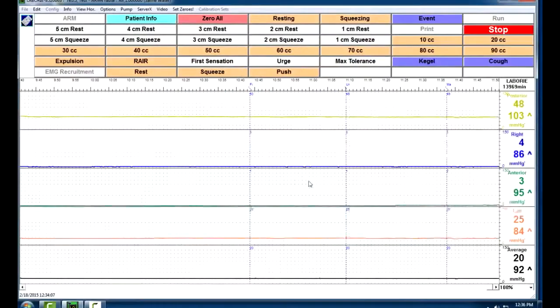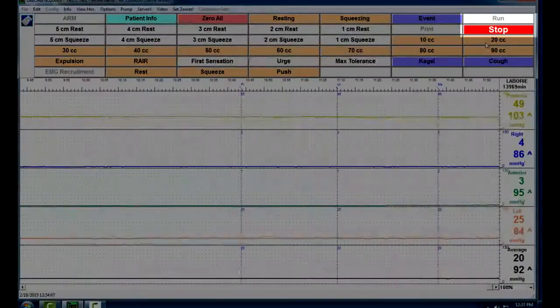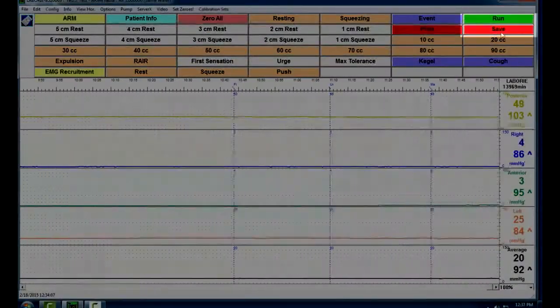Let's go ahead and stop our test now. We're going to click the stop button, followed by the save button, and save the data.